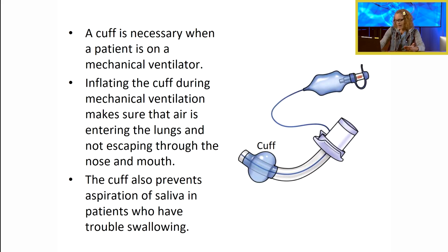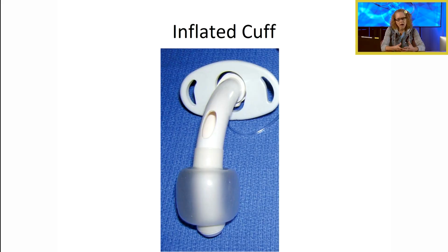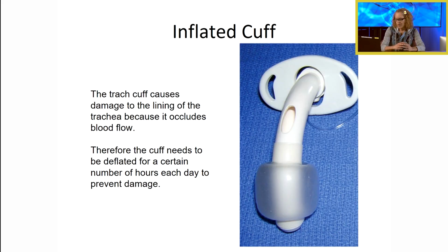But again, that cuff can cause some damage as well, right? Still that risk for damage to the lining. So we want to keep that cuff pressure as low as possible, all right? And we also want to relieve that pressure every so many hours while the patient is under our care.